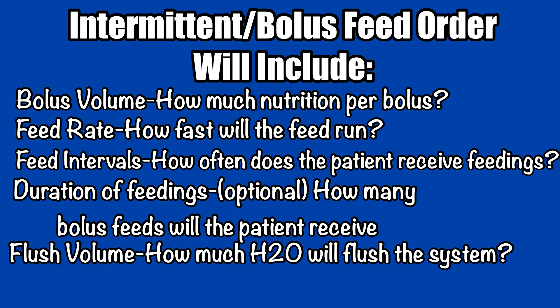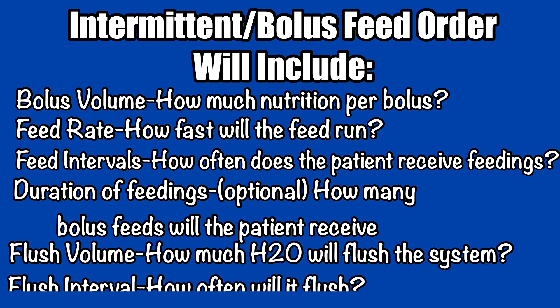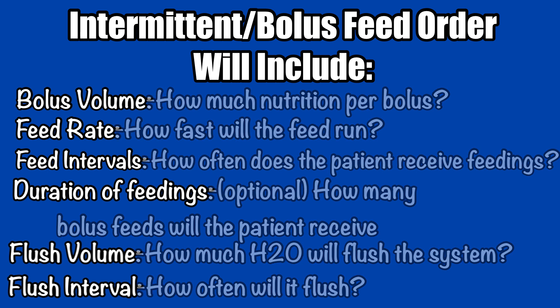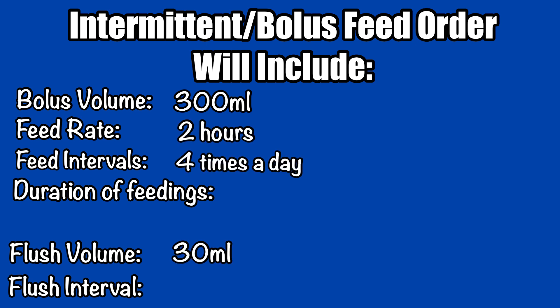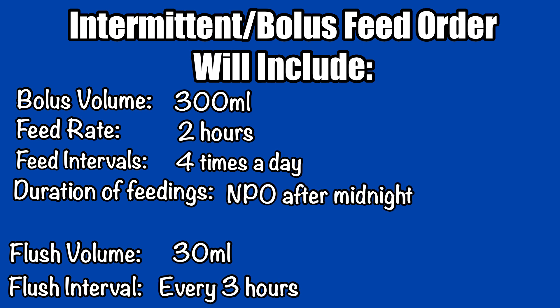You'll have flush information for volume and interval as well. For our programming example, we'll say our order states the patient will receive 300 milliliter feeds over two hours, and they are to receive this four times per day. They should receive a 30 milliliter flush every three hours. We'll also say that the patient is to be NPO for a procedure starting at midnight tonight.